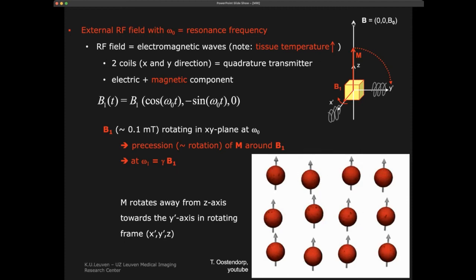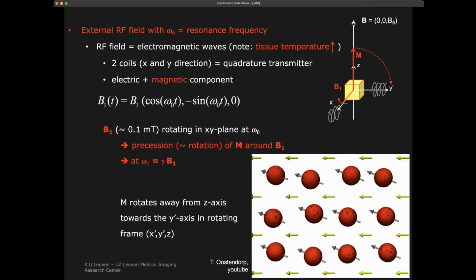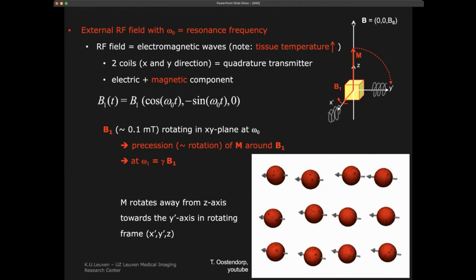We put the patient or the object in this field, and then we leave this on. And what then happens is, first, we let all the protons orient themselves in that direction. It becomes a little magnet itself. And then with radio frequency energy, we can flip the direction of this magnet so that you get this type of rotation.